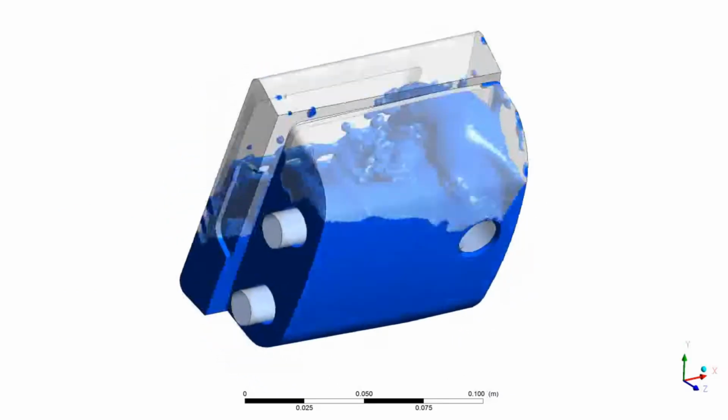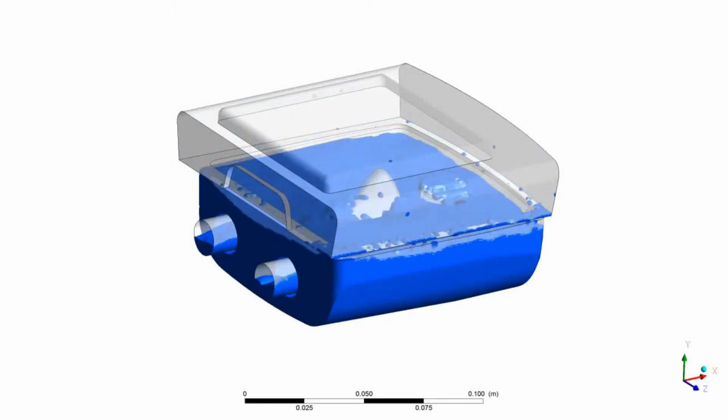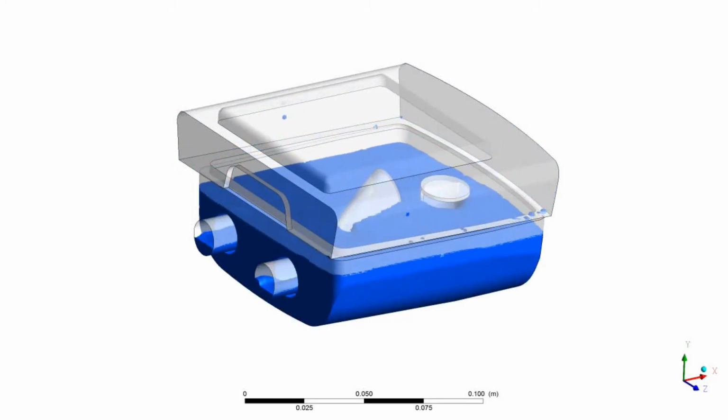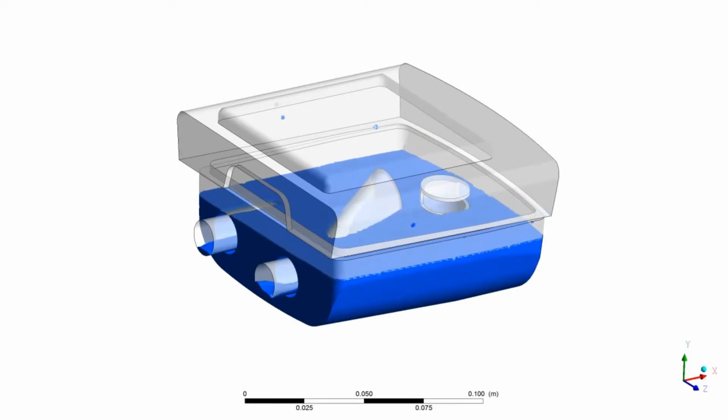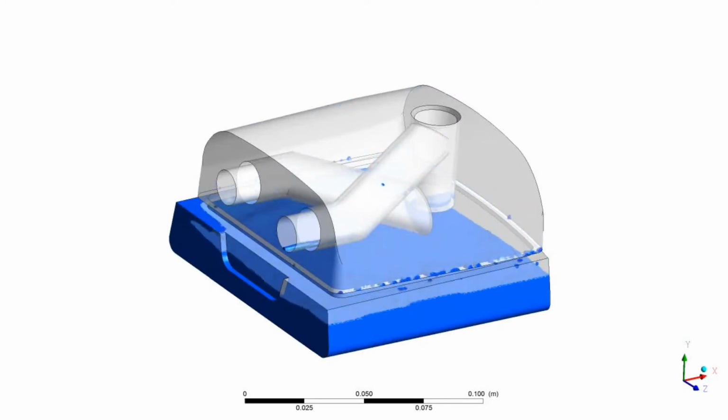We then send it off to get solved, so we wait about 14 hours on 32 cores, produce 90 gigs of data, and we get this. Simulation where we just flip the tub upside down. We can see we get a bit of water sort of pouring out the inlet or the outlet. I just flip it back around for the sake of it.